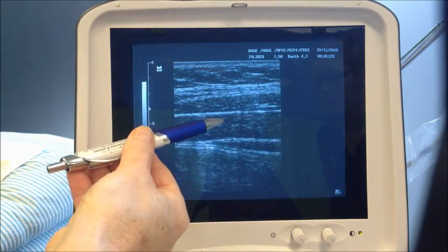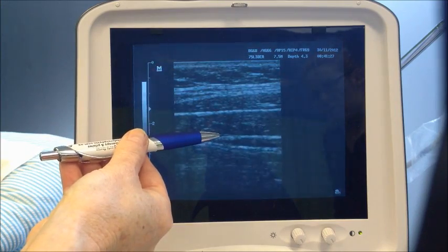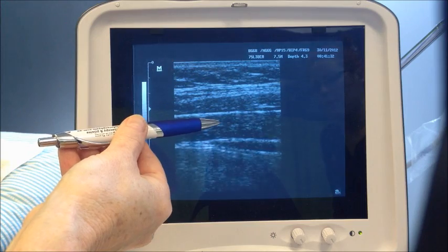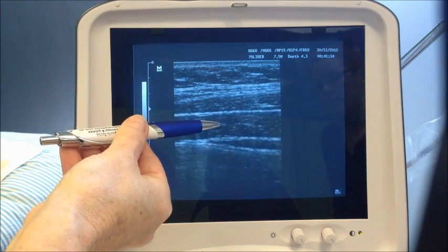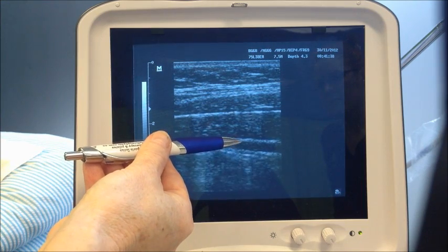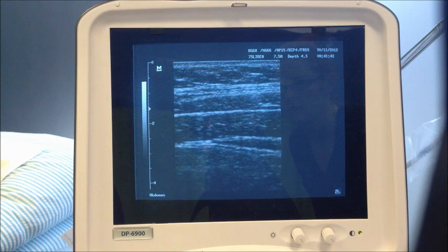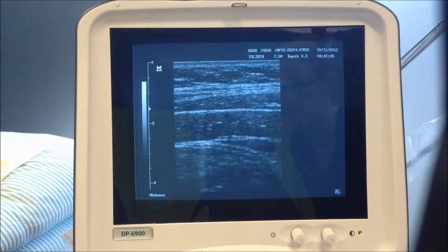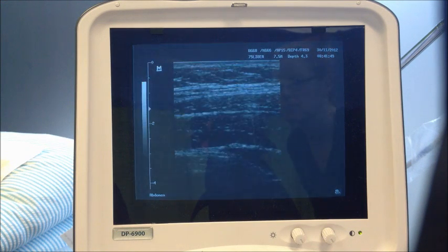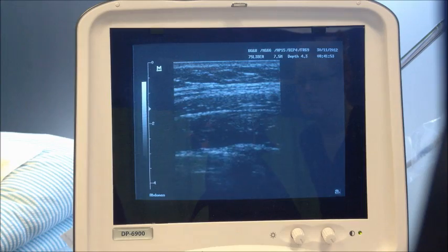We do see a thickening and a tightening of the internal oblique, and they often co-contract together. What's really important is that this internal oblique does not take over the effort from the transverse abdominis. So again, as you gently continue to breathe, just try and draw that muscle in around towards your spine. Hold it there, and continue to breathe.